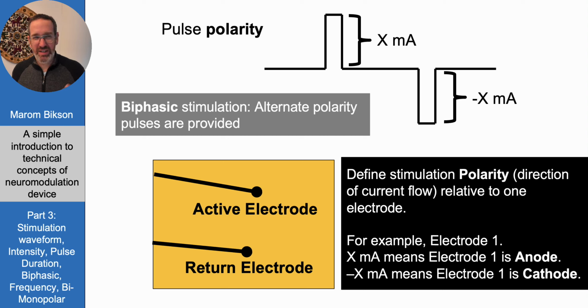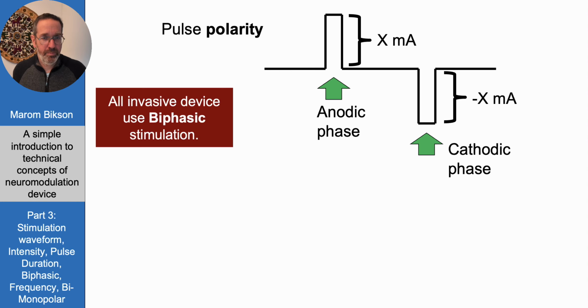Now again, this may seem a bit of an esoteric concept, but it's just something I think you need to keep in mind, because maybe it will come up in the process of describing a particular neuromodulation approach. But what is certainly true is that almost all neuromodulation, and all invasive neuromodulation, with very few exceptions, will use a biphasic stimulation, so that each electrode is doing a push-pull, right? Or a pull-push, right? So that's what we call biphasic.